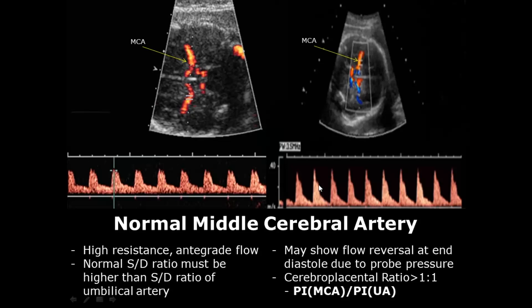The normal SD ratio of the MCA must be higher than the SD ratio of the umbilical artery. It may also show flow reversal at the diastolic section, which can be due to increased intracranial pressure caused by applying pressure with the probe.